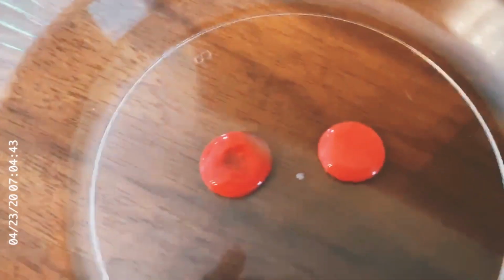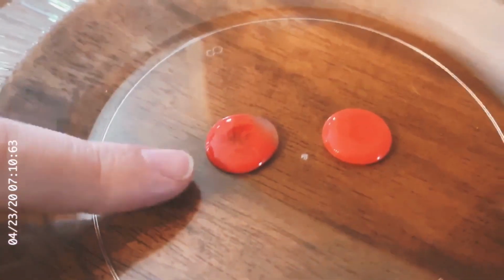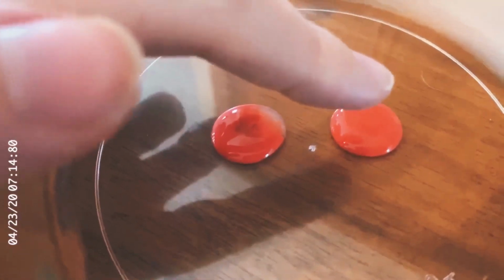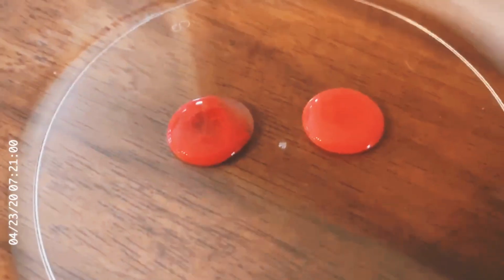So now we're looking at our 2 different blood samples here. I would definitely say that this left one is clotted, so that would be a positive test, and this one over here is not clotted, so that is a negative test. So you should put a positive for anti-serum A and a negative for anti-serum B for Ellen.